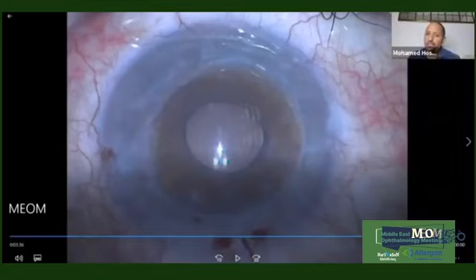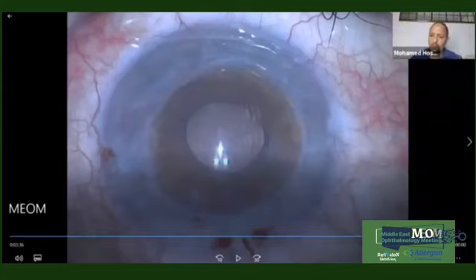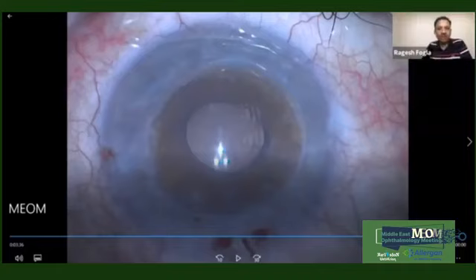Have you found that in these patients, sometimes marking the cornea and getting the toric IOL on axis is a little bit trickier than in normal, virgin cataract cases? No, sometimes getting the axis itself is very difficult in these eyes, because if you measure them on 3 different instruments, you don't get exactly the same axis in all 3. Yeah, so there can be a few degrees. This is where it depends on which optical zone you are using to calculate the astigmatic axis.